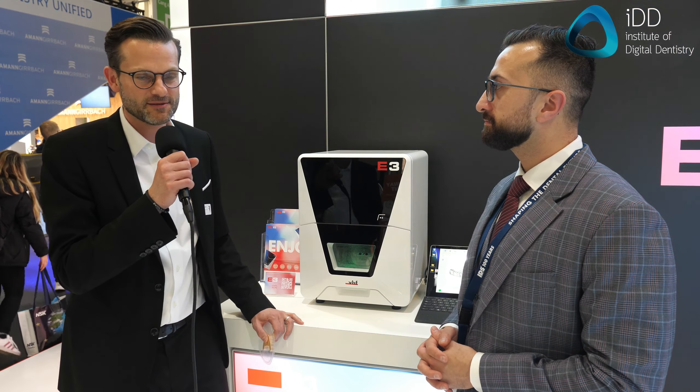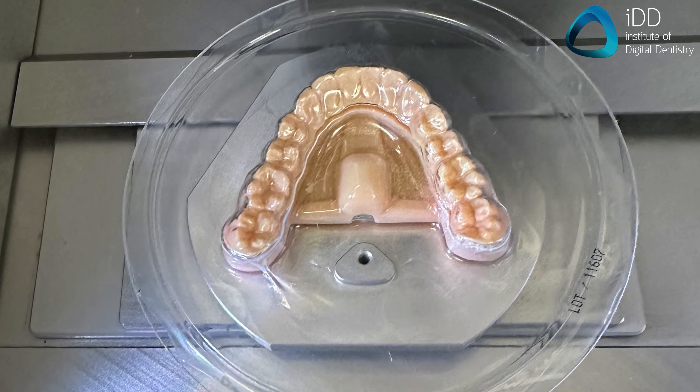Fantastic. Thank you so much for visiting our booth. We're very, very excited about this new release. We launched this product just yesterday. It's an aligner trimming machine. It trims thermoformed aligners, bite guards, sports guards, night guards — you name it. Let me quickly show you the process.